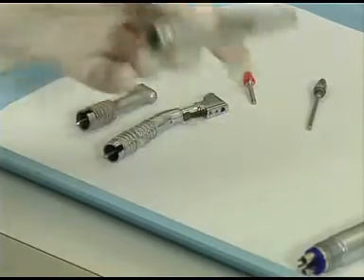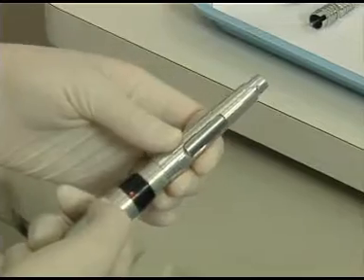Identify the straight attachment. Slide it into place on the motor base, making sure it is locked into position.